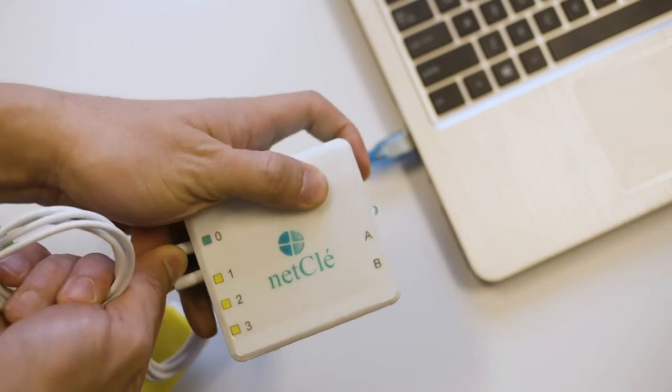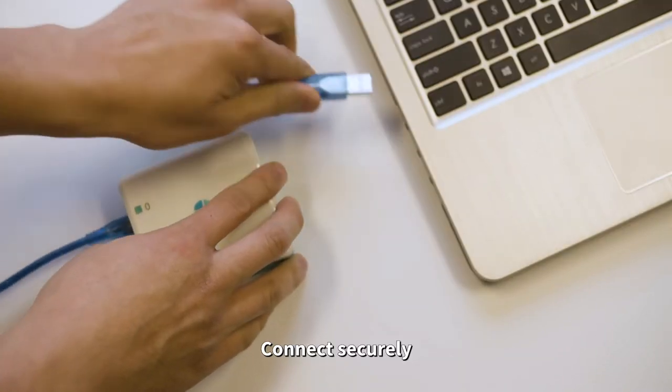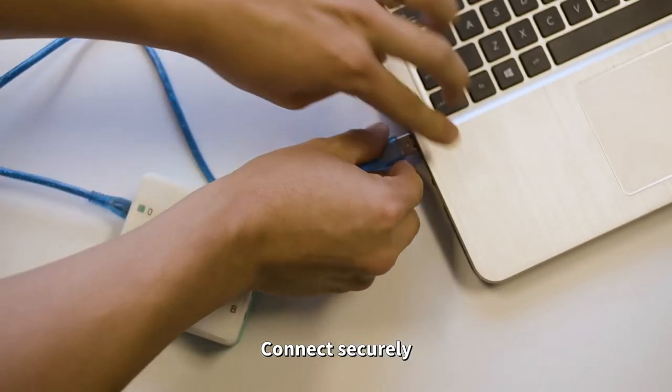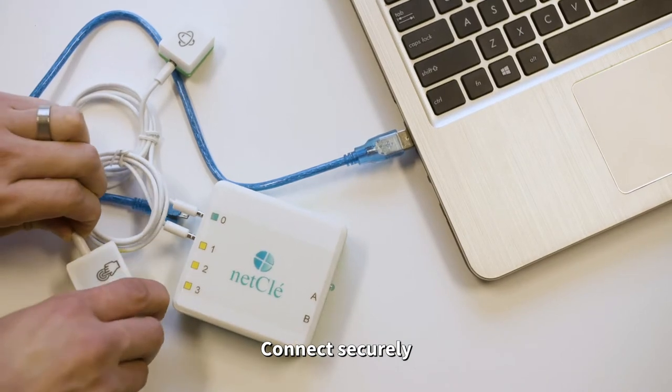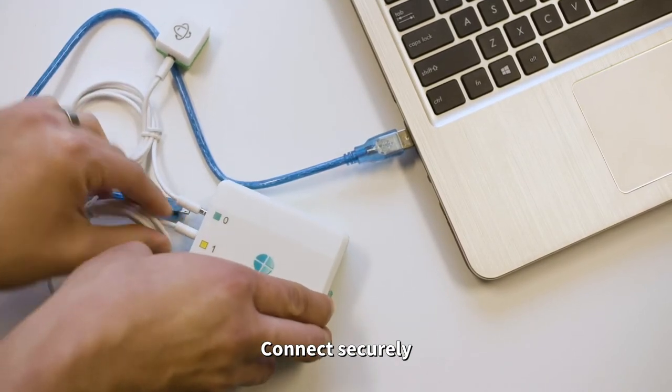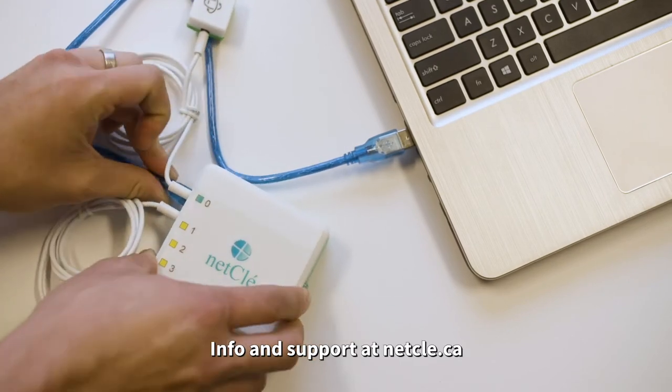To begin using netClé, ensure the desired peripherals are securely connected to the hub and connect the hub to the computer using a USB cable. In case you run into any issues, make sure the cables are all firmly connected. Please refer to the netClé user manual for more detailed troubleshooting support.